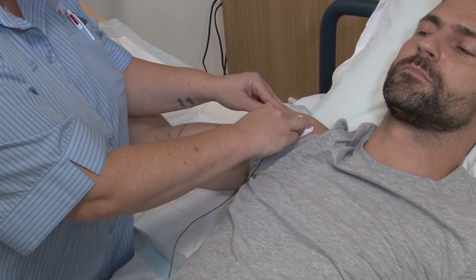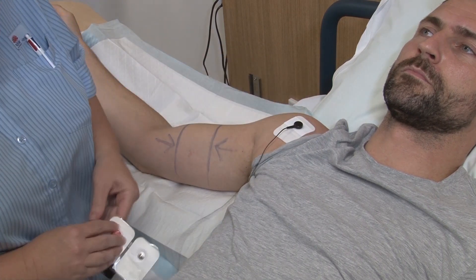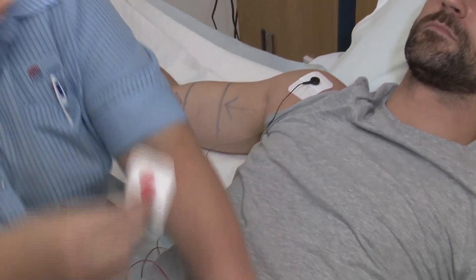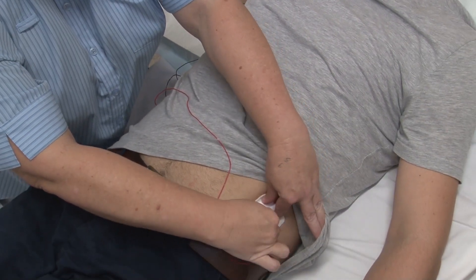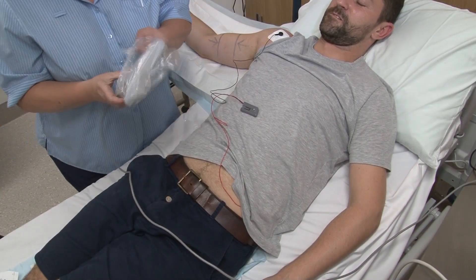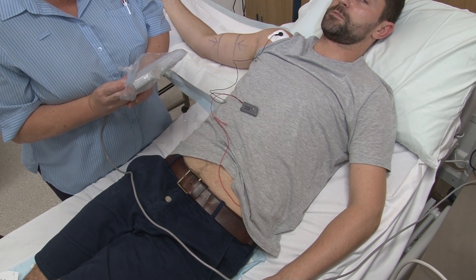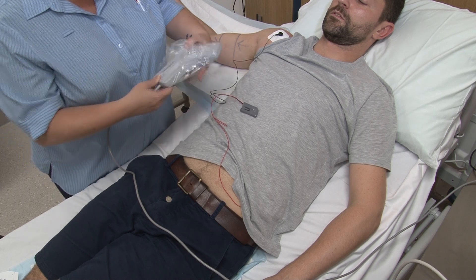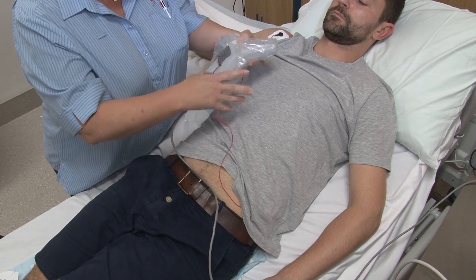The patient should be attached to ECG monitoring to provide a baseline or surface ECG trace. Lead 2 will provide the clearest P-wave. Next, a Y-shaped chest plate should be applied high up over the sternal notch. This allows for detection of the PICC as it advances to the cavo-atrial junction through the chest. This will be demonstrated later.